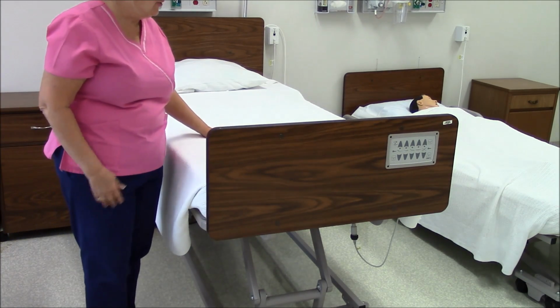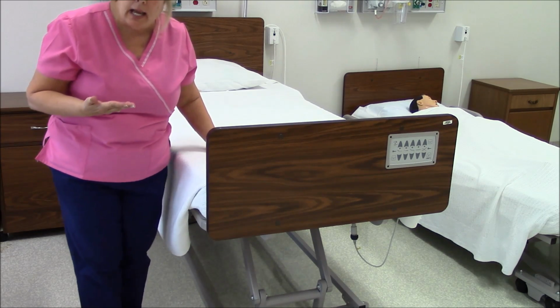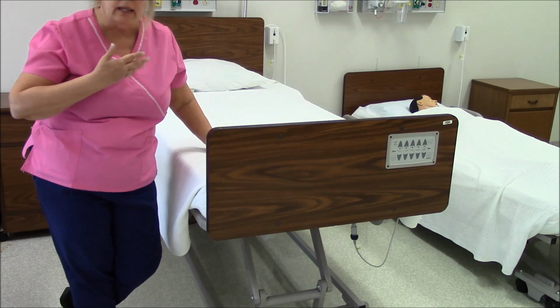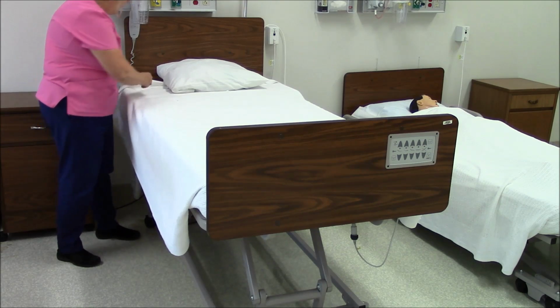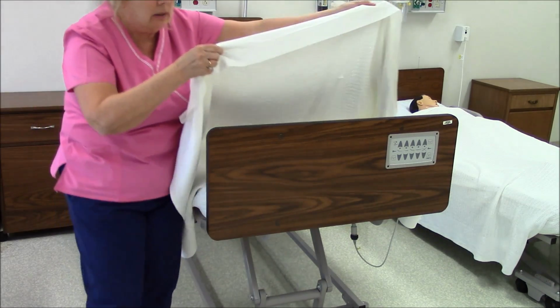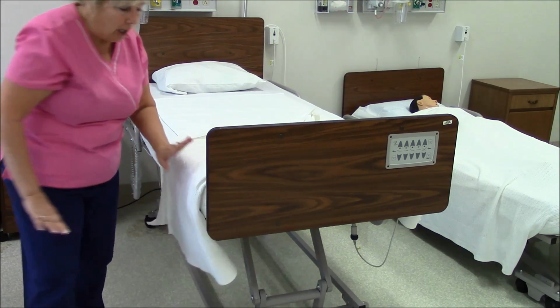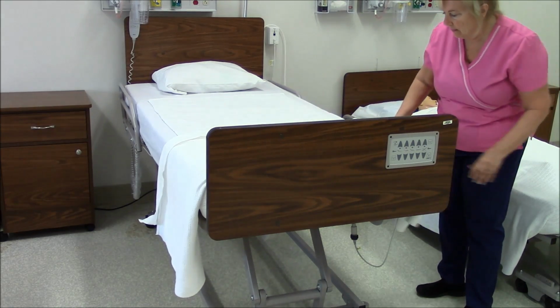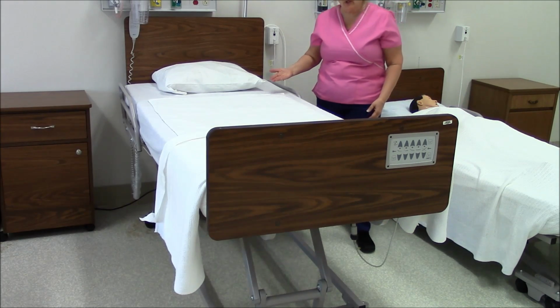I would just like to show you one more type of bed. When you do have a closed bed, and let's say you've got to call a patient or a resident is coming up, I'm going to make the bed more inviting and turn it into an open bed. All you have to do is take a hold of your cuff, bring it down a little bit past the foot of the bed, and fan fold it over. Your mitered corner is still intact. And there is your open bed. It is all ready for your patient.